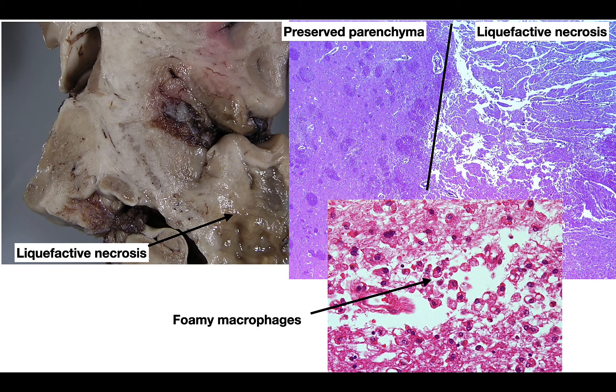With liquefactive necrosis — abscesses are a form but without the neutrophilic infiltrate seen in typical abscesses. Liquefactive necrosis is most commonly associated with the brain. At the top we see a low-power image; to the left is relatively preserved parenchyma and to the right is the liquefactive necrosis, where the tissue is just breaking down. The neurons die, the axons and dendrites die, foamy macrophages come in and engulf them — at the bottom those cells filled with debris are foamy macrophages engulfing myelin and other cellular debris.